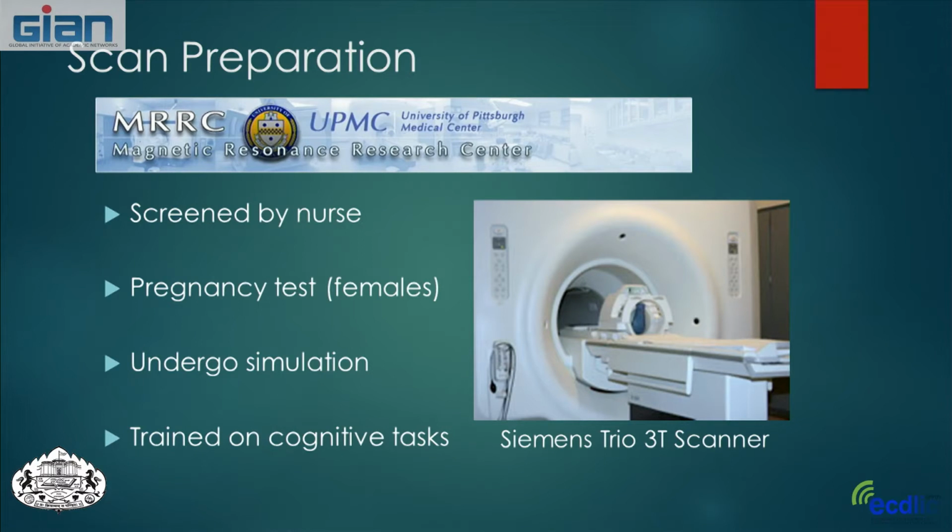We have a little thing that plays the same noises that they'll hear when they're in the machine, so that they can decide if they feel like they would be able to lay in this scanner for an hour or more. And we did a study where we looked at children, and this was especially important for making sure the children felt comfortable in this environment before we subjected them to the actual scan.